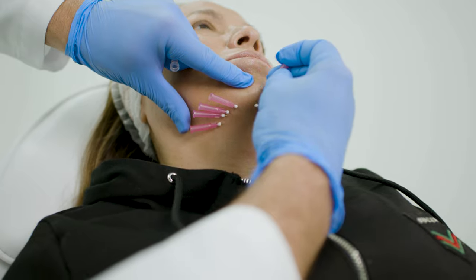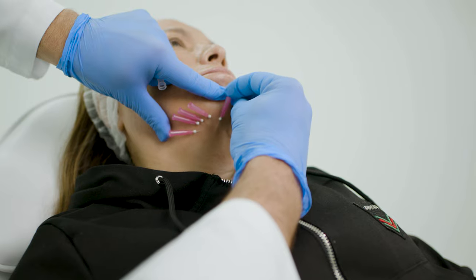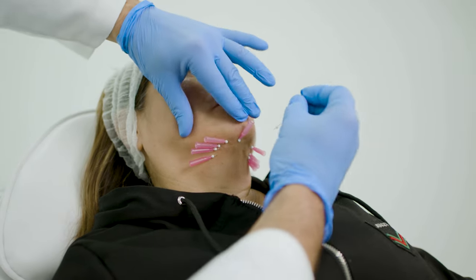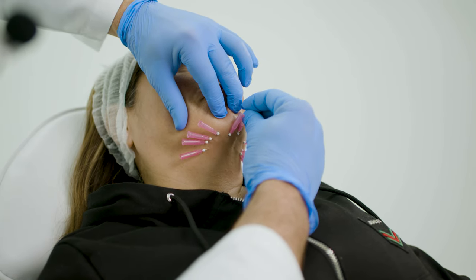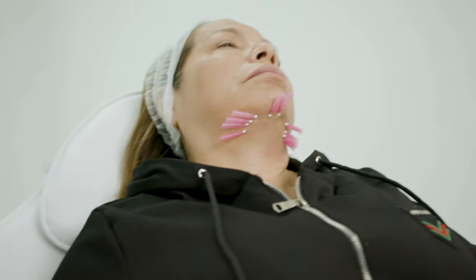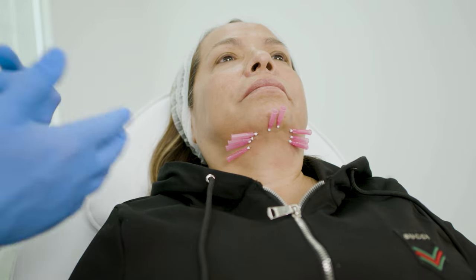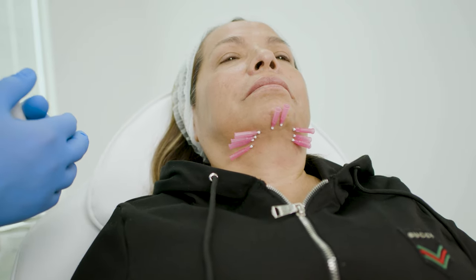Occasionally, if we go to put these in, sometimes I'll hit the other ones and have to work a little bit with it. Once we get them all in place, you can take a photograph as part of your medical record. As you can see, this is 10 threads placed in this area. We could place more, or we could take these out and do a whole other 10 at the session, or bring the patient back in four to six weeks and see the results.